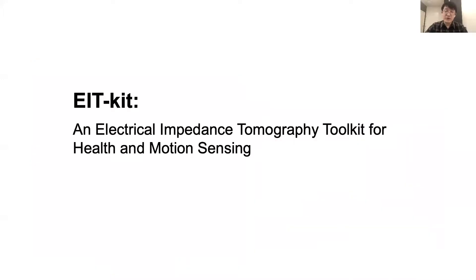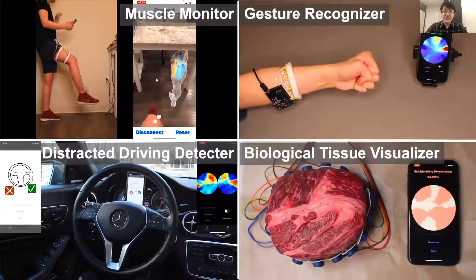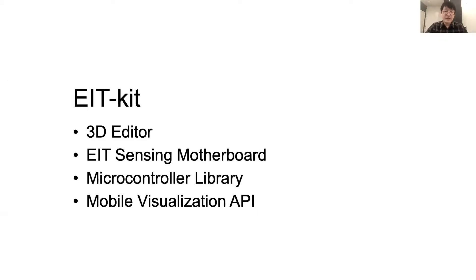In order to make EIT sensing more accessible and easier to use, we built EIT Kit. EIT Kit supports users across different stages of EIT device development, so users without EIT sensing knowledge can design and fabricate novel applications. EIT Kit contains four components: a 3D editor for personalizing the form factor of electrode arrays and electrode distribution; a customized EIT sensing motherboard for performing electrical impedance measurements; a microcontroller library that automates signal calibration and facilitates data collection; and a mobile visualization API for interpolating and visualizing the measured data on mobile devices.